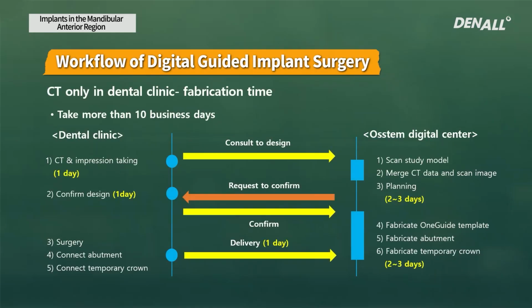The process is a little bit complicated. You need to interact with the design center. Once the template is confirmed, you use the template for the surgery. It is an online interaction, but still the process is required. If you think it is cumbersome, you may not like it. But if you take some time and get used to it, I believe this is a good way.